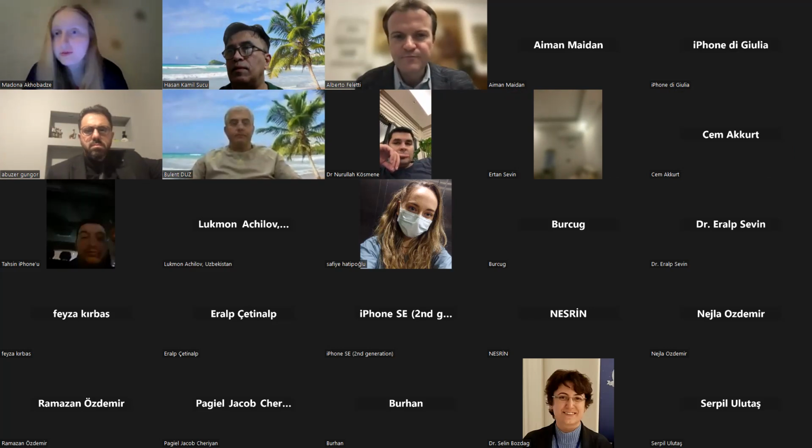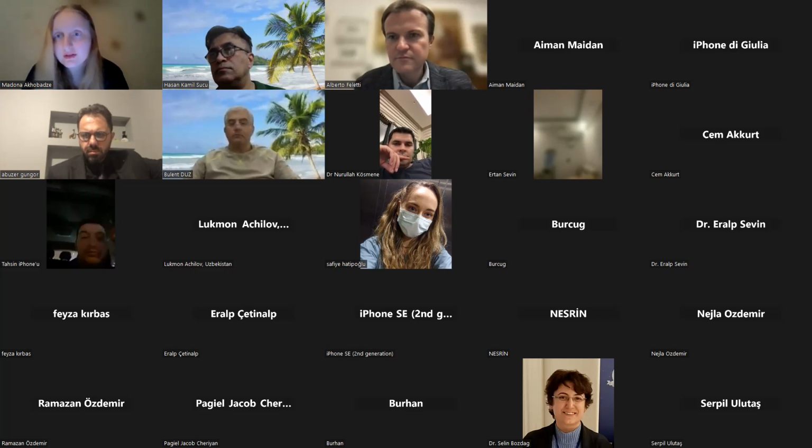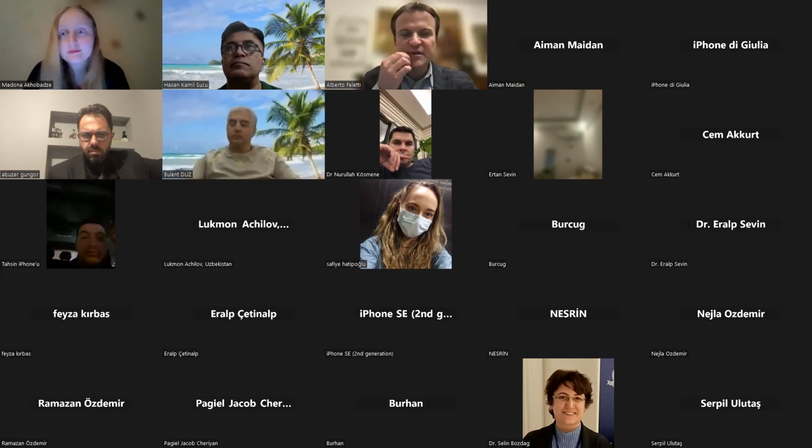And we have a follow-up question from Ayman. For pineal region, do you use endoscopic biopsy through the same burr hole as for ETV, or do you insert an additional burr hole? No, I always use just one burr hole.